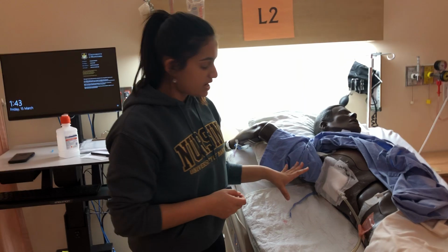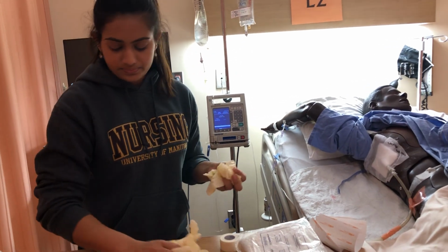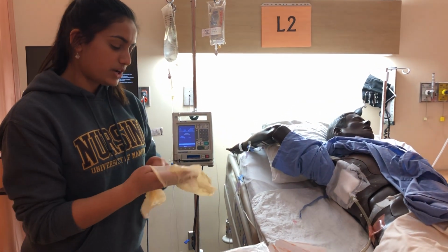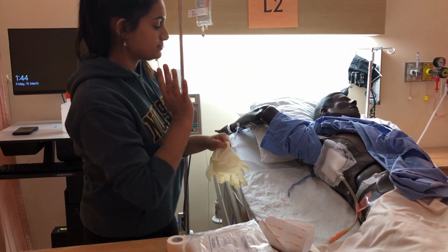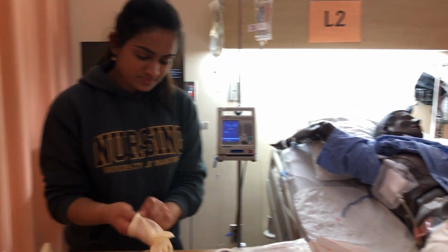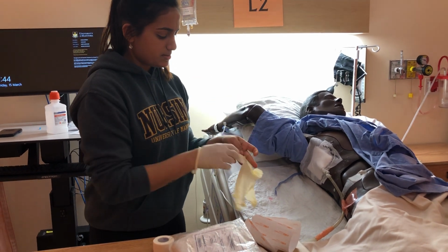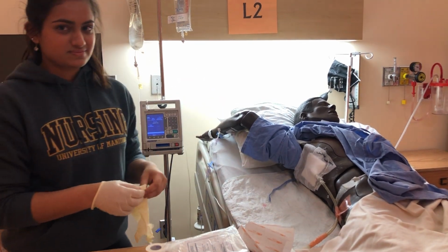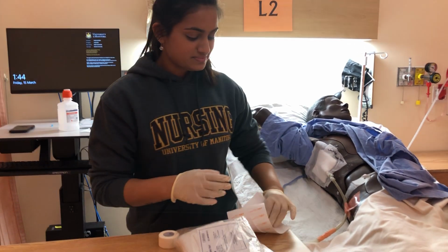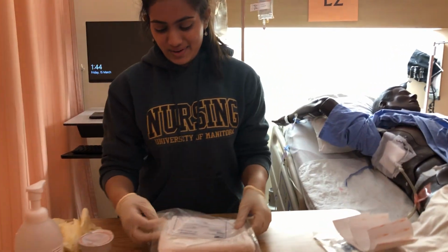So the dressing's dry and intact. There's no shadowing on the dressing. Alright. And I would also address any need for analgesia prior to changing the dressing, so I'm going to perform hand hygiene one more time. It's important to keep the bottom. So I'm going to first set up my sterile field. And also I've just assessed the site here, made sure there is no shadowing. Okay. And it's fine that I touched my sweater because I'm not touching the patient. Okay.